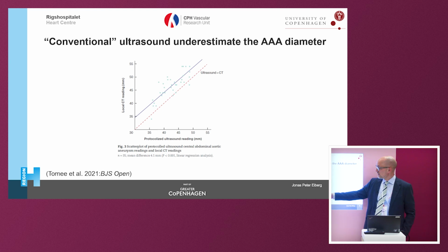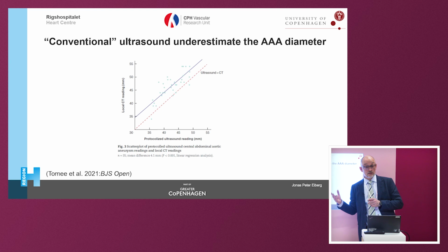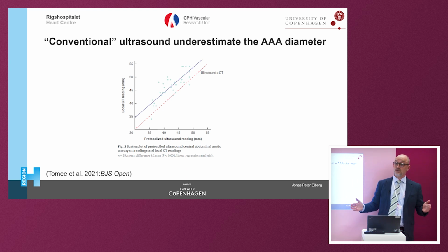But this is well known. This is the same aneurysm measured with ultrasound and with CT, and you can see these lines should overlay each other, and they don't, and there's approximately half a centimeter between. So this is half a centimeter, and before you could miss 1 centimeter, now it's suddenly 1.5 centimeters if you are unlucky. Sometimes these mistakes are good for each other because they reduce each other, but if they lay on top of each other, it can be a lot.